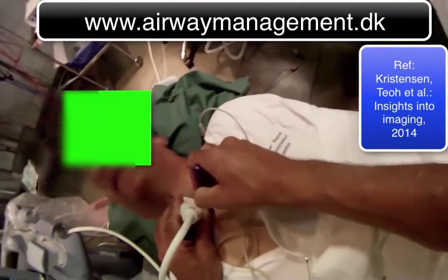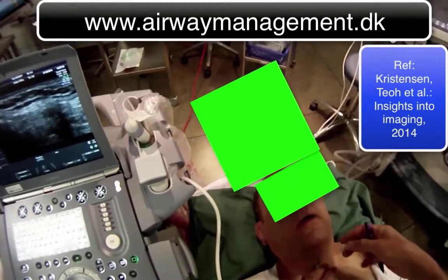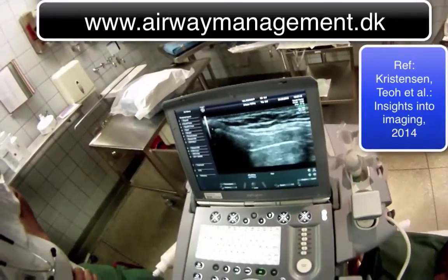We mark that. Now we can slide a needle underneath the transducer, using it as a marker only.